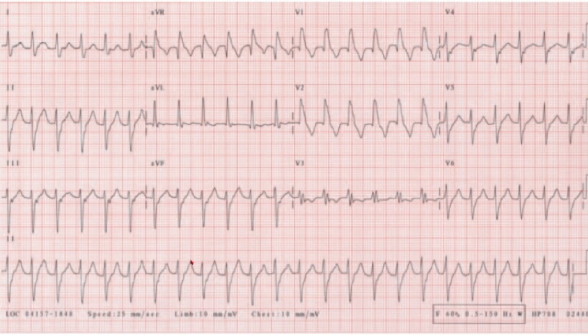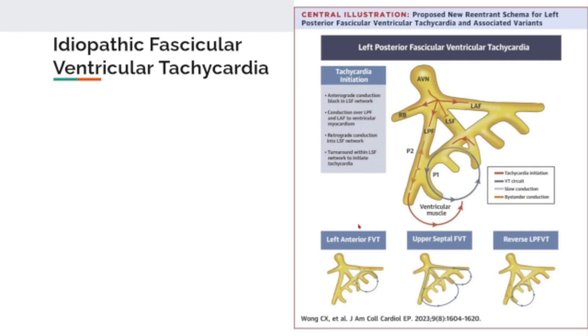There are no obvious P waves visible anywhere along this rhythm strip. The rate is 142, and there is also a left anterior fascicular block. Based on these findings, this patient is diagnosed with idiopathic fascicular ventricular tachycardia.